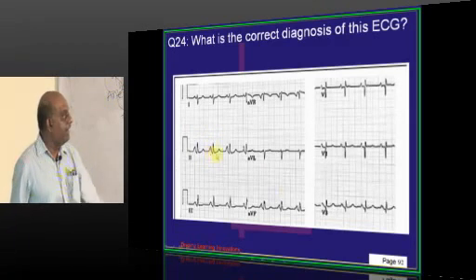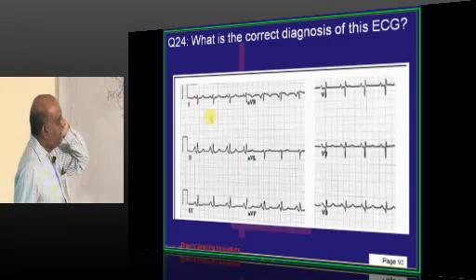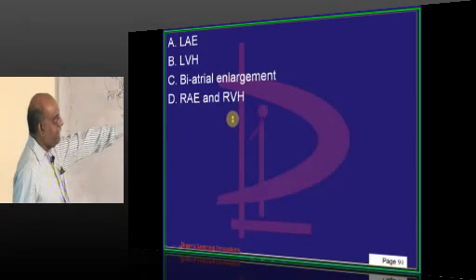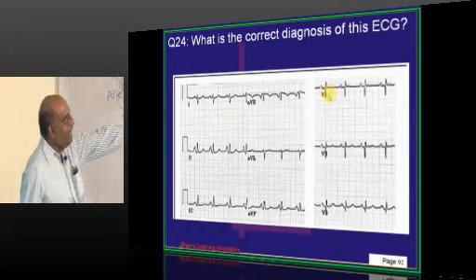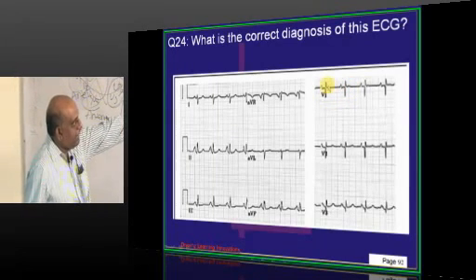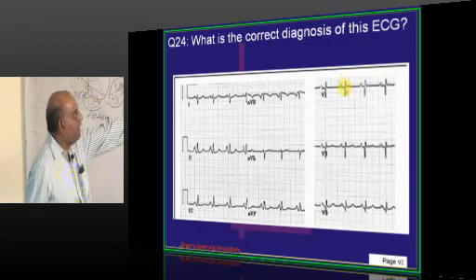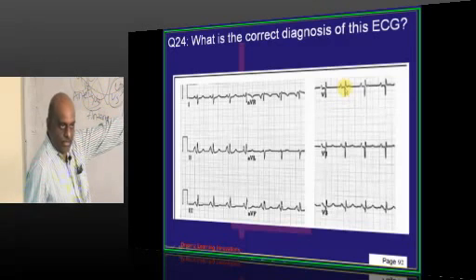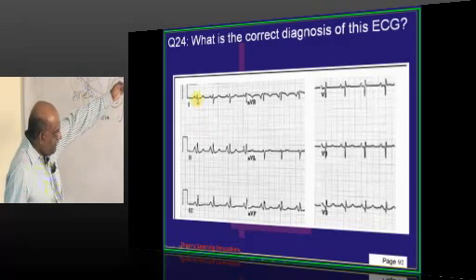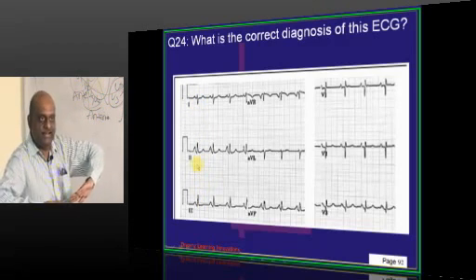Right atrial enlargement. And if you look at the axis, how is the QRS? It's a case of right atrial enlargement. Then what else? If you look at the lead V1, what do you find? In the lead V1, you are finding positive R wave, okay? And lead 1 and 3 you compare, 1 is drooping down, 3 is looking up, they are right towards each other.